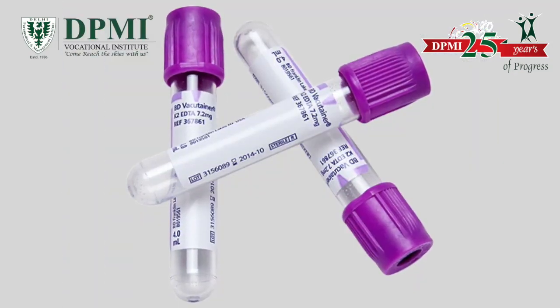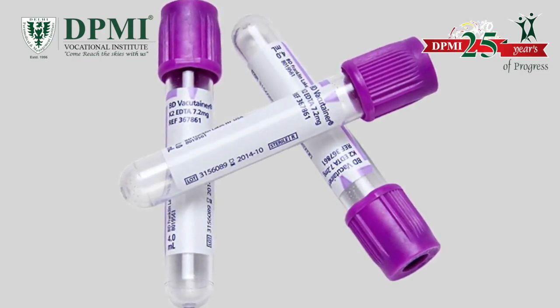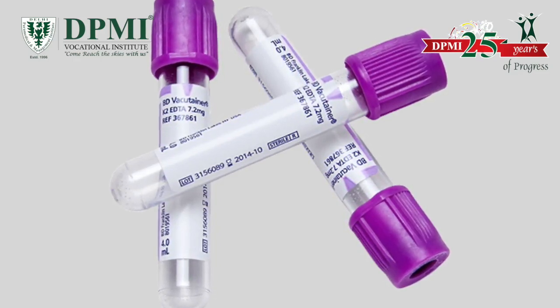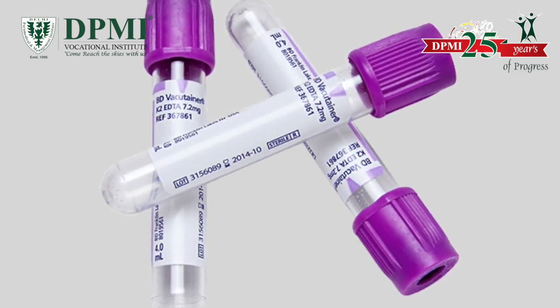Lavender top. These tubes contain EDTA as an anticoagulant and are used for complete blood count, blood smear, and blood typing and screening.